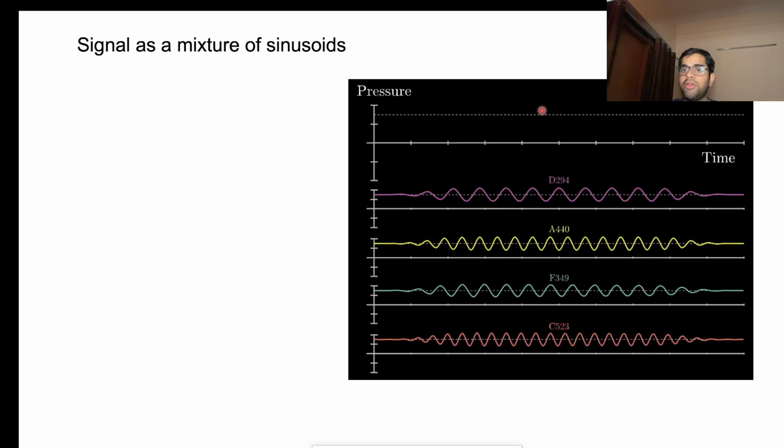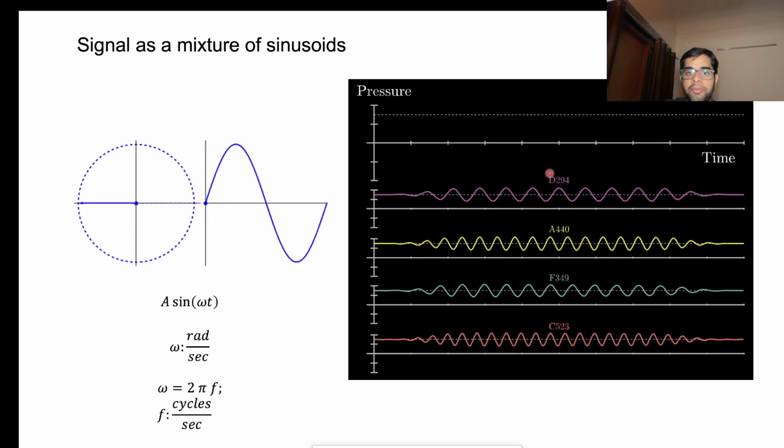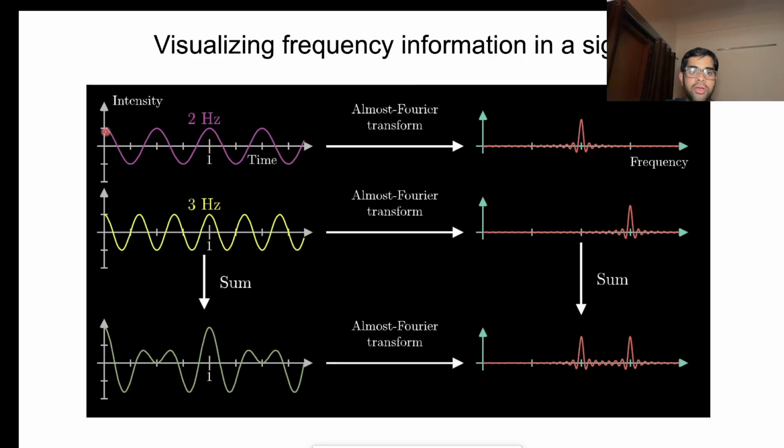So when you do a Fourier transform, when you convert a time domain signal from time domain to Fourier domain, you see a frequency domain, you see the peaks. For example, if I show you only one monotonic oscillation, you can count and tell, but that is a lot of effort. You can count even in a complex signal and take an LCM, but to the naked eye you can't do it. So for that we need a tool to transform the same signal into its Fourier or frequency domain.